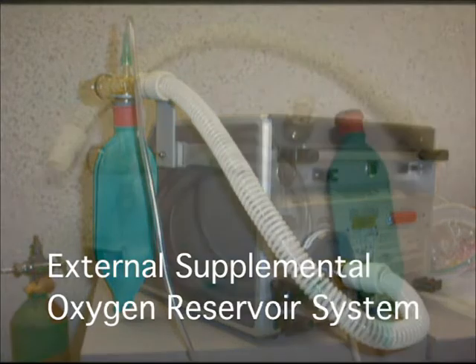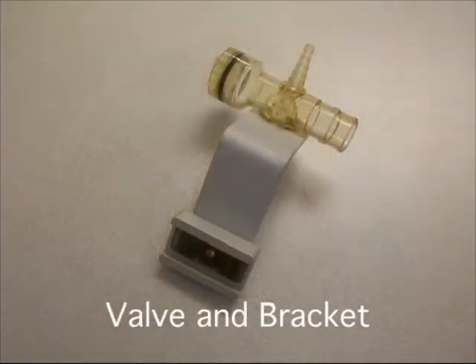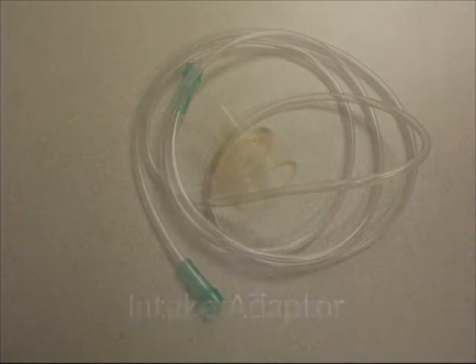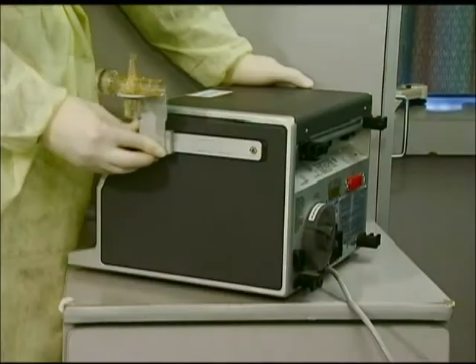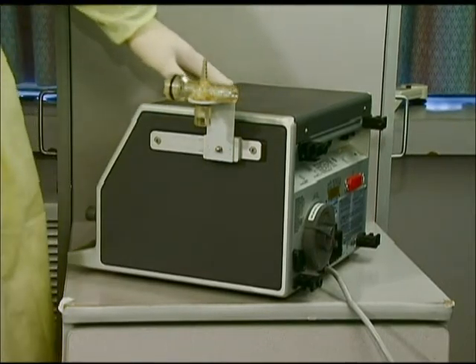The external supplemental oxygen reservoir system consists of several key pieces: the valve and bracket, corrugated hose, oxygen tubing, intake adapter, and the reservoir bag. Attach the valve and bracket assembly to the side of the ventilator unit by sliding the grooved opening onto the accessory arm.